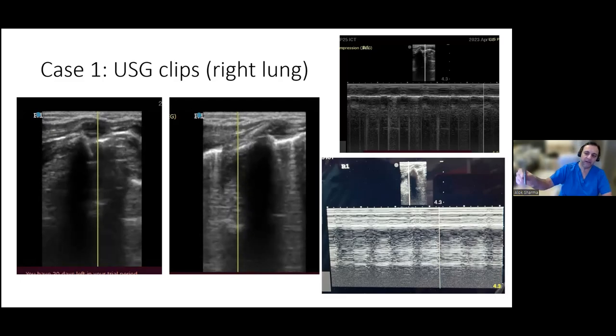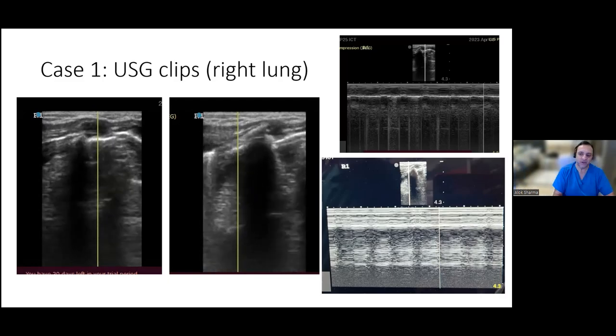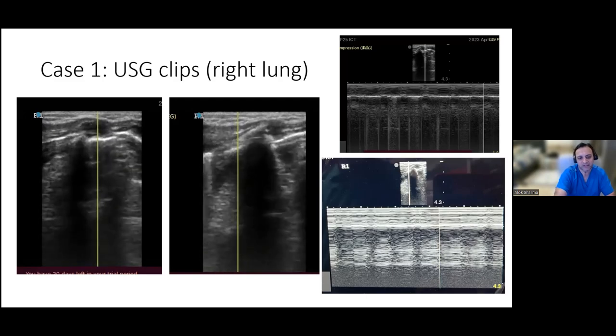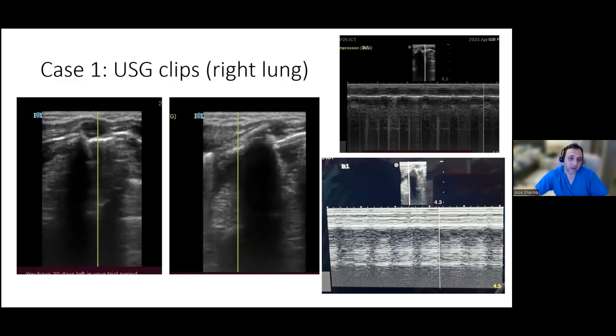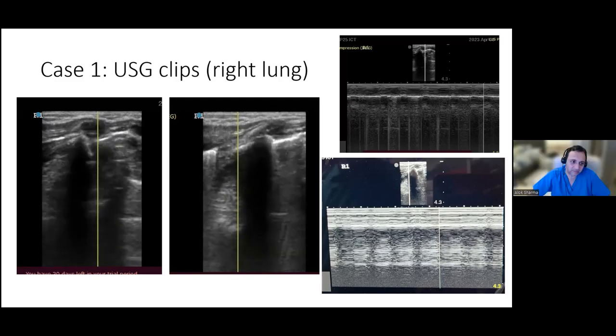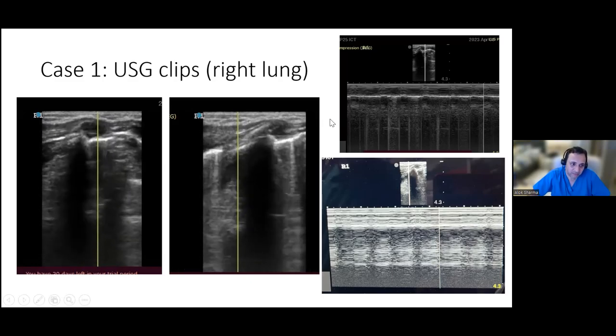So holding the probe, most of us, when we hold a linear probe, we tend to hold it from the top and we lose that hand stillness. And really what I'd like you to do is try practicing holding it right from the bottom so that you can actually keep it near the surface of the skin. So I would agree there's no pleural sliding in between, but I can't see what is classically an A-dash profile. When you look at R1, you probably do have an A-dash profile because I can see some A-lines in the middle.